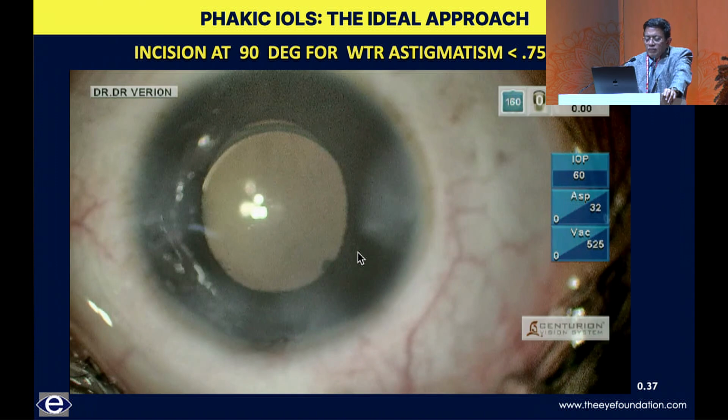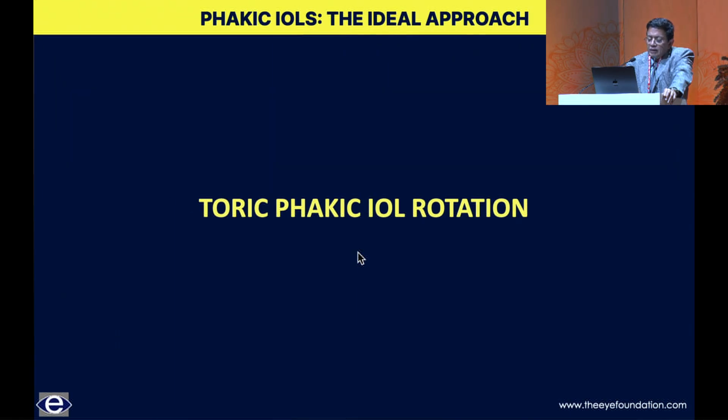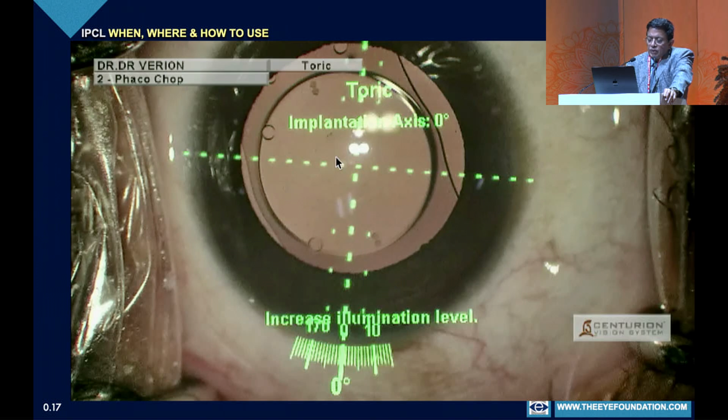It's important that whenever you have significant myopia or hyperopia with toricity, you have to deal with it completely, because even a small amount of cylinder left behind leads to dissatisfaction in the patient. As far as toric phakic intraocular lens rotation is concerned, you can see the Verion overlay here, and these are the toric markings on the lens. This is an Indian toric lens, which we also quite commonly use. As you can see, the alignment is not really perfect. The time to realign these lenses is when the residual spherical equivalent is almost zero, because when you realign these lenses, you are not introducing or taking away any power, but redistributing the power. So if it is -1 with +2 diopters of cylinder, then this rotation is going to help. But if it's just -2 diopters of cylinder, it's a basic error in the calculation of the lens, and lens replacement may be what is necessary.